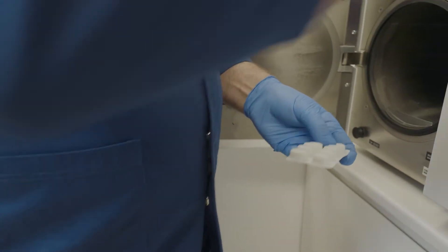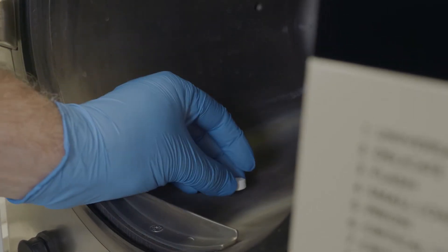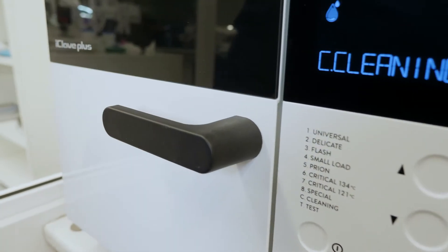Grab a regenerating tablet and place it in the bottom of the chamber. Close the door and ensure the cleaning cycle C is selected.